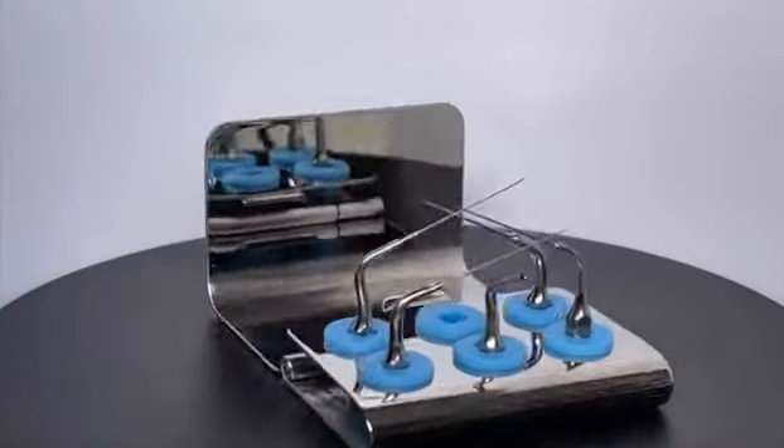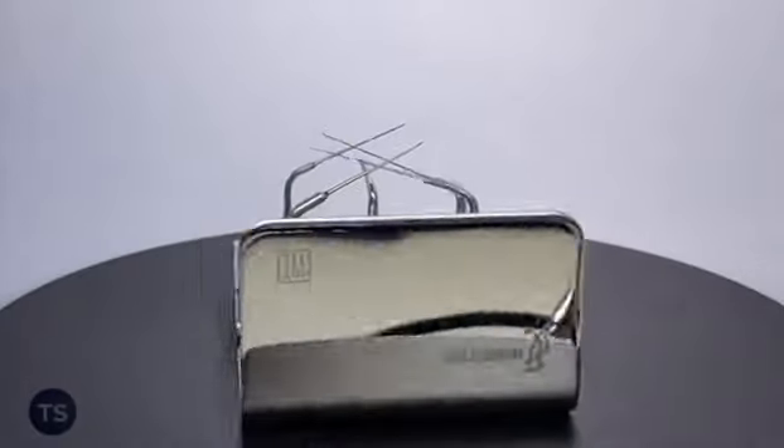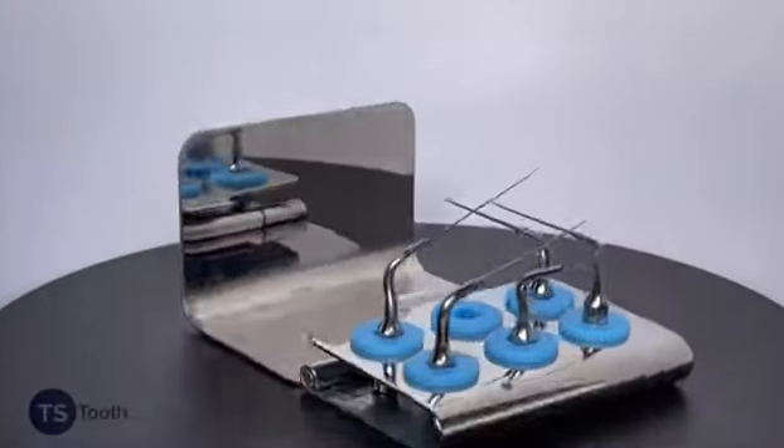I'd like to introduce our ultrasonic kit. This is for our irrigation activation. We have five different tips available in this kit.